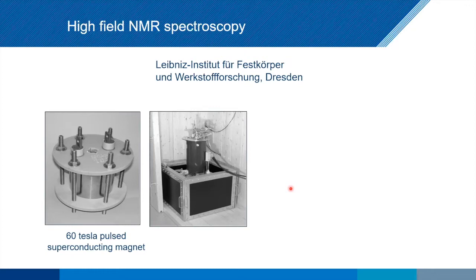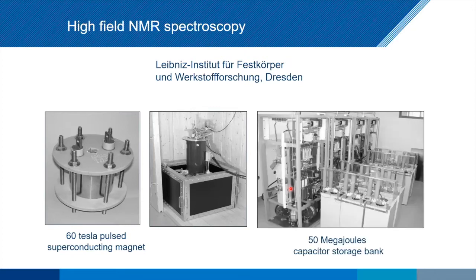But this is no normal capacitor, okay? This is probably the largest capacitor you've ever seen. This is a 50 megajoule capacitor storage bank that is in the room right next to the MR machine. So essentially our experiment is the following. We have to cool down the magnet. We have to discharge 50 megajoules, which means that in Dresden, the lights literally went down for about 3 seconds when we do that. The field is going to go from 0 to 60 Tesla and back down again in 20 milliseconds. And we have to time it exactly so that our coil, which is tuned, I'll explain why in a second, at 56 Tesla, gets the FID there.